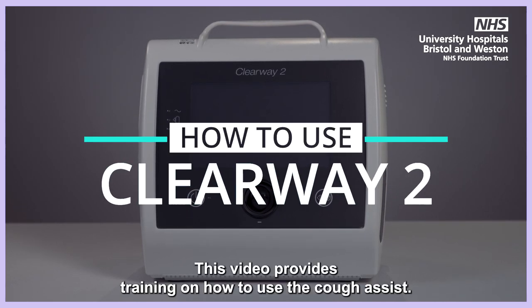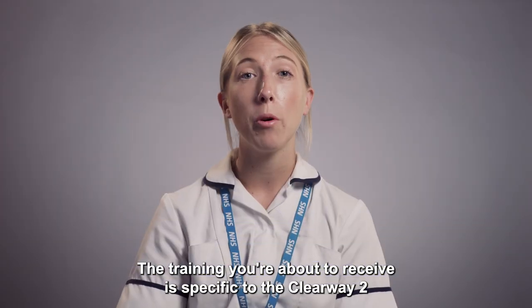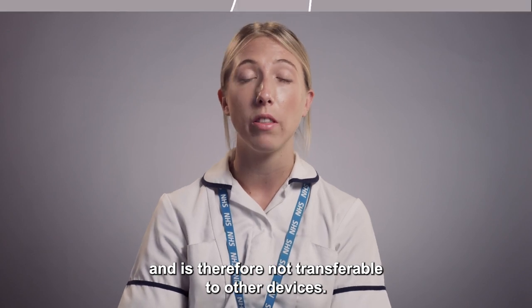Clearway 2. This video provides training on how to use the Cough Assist. The training you are about to receive is specific to the Clearway 2 and is therefore not transferable to other devices.